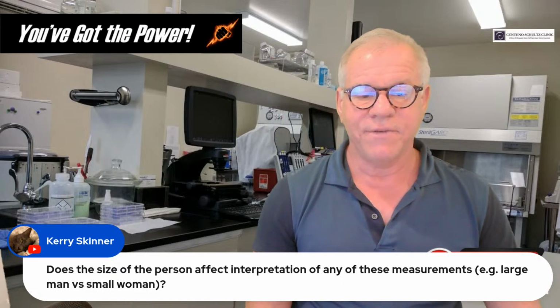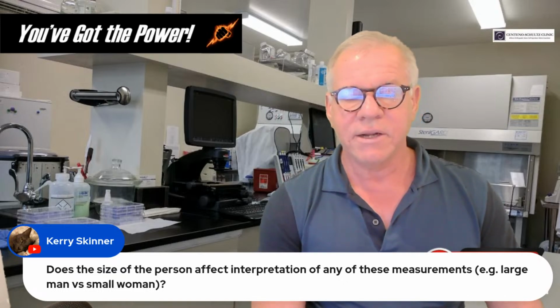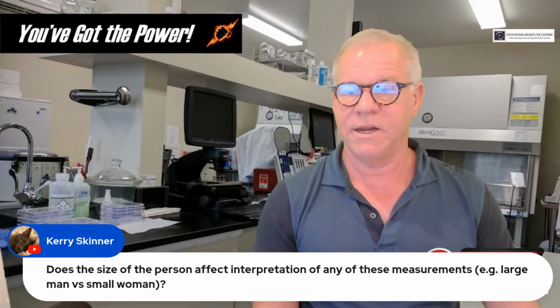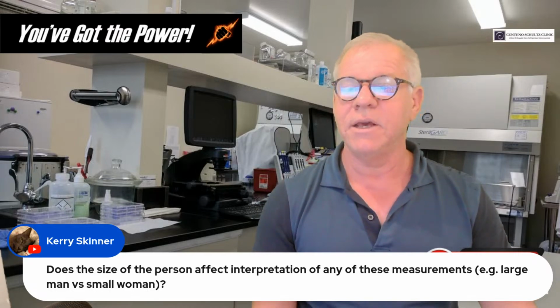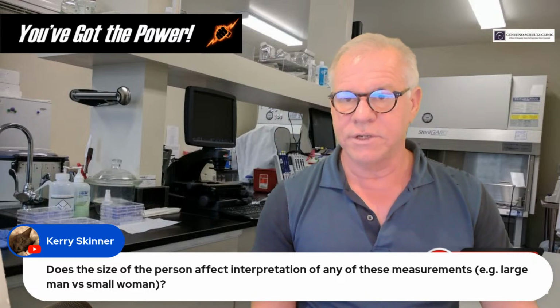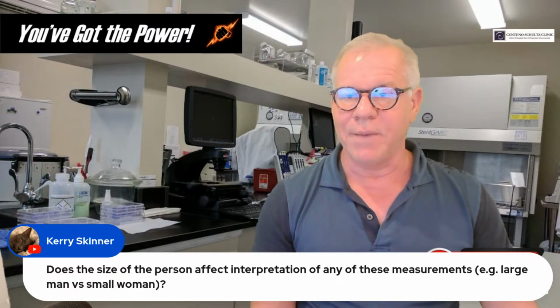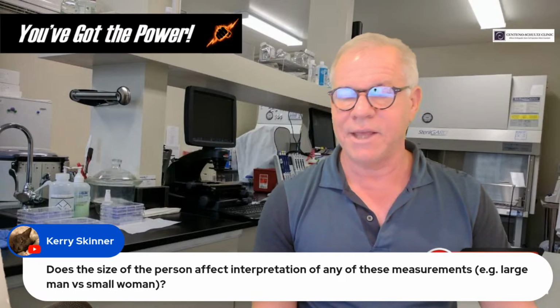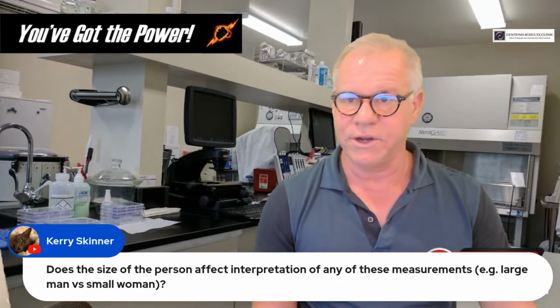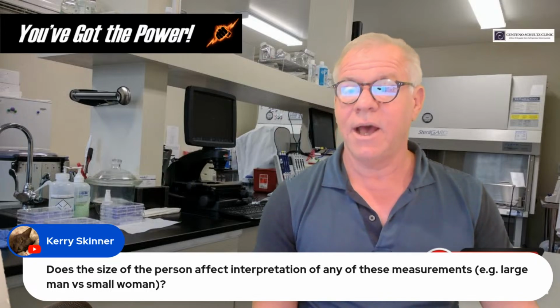Carrie, does the size of a person affect interpretation of these measurements? Yeah, Carrie, it's an important point. Meaning none of these measurements are hard absolutes. They do depend on the size of a person. Now, the good news is these measurements don't vary a lot, meaning if you're talking about the differences between the average size man and the average size woman, there's not a huge difference, for example, in the width of the dens.